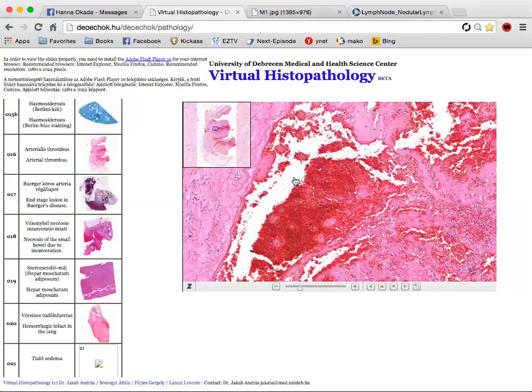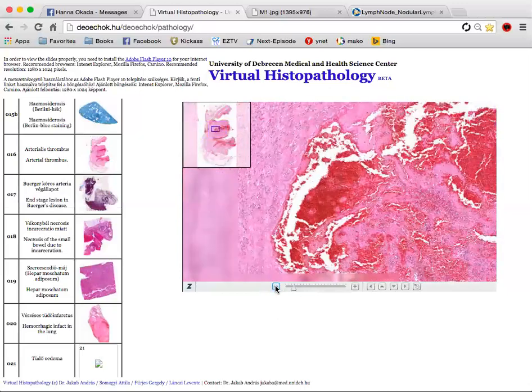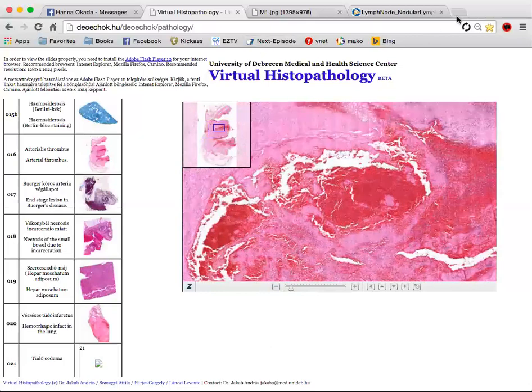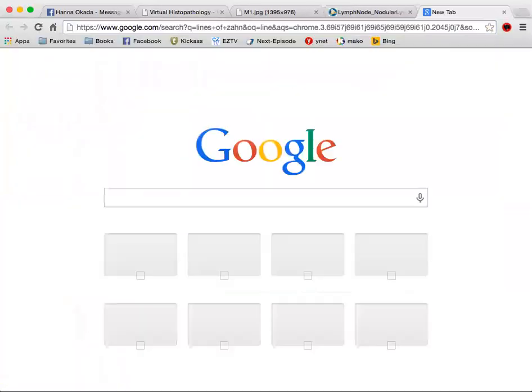Okay. All right. So, yeah, I guess we have to mention where the thrombus is, where the fibrinoid region is, and then recanalization. Yeah, that's it. And they might mention the lines of Zahn. I'm going to show you a picture here.